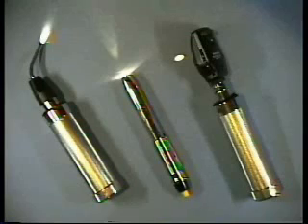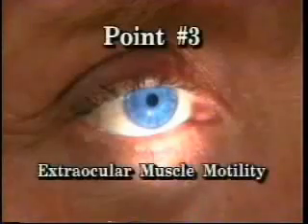The third through the sixth points can be evaluated with a Finoff transilluminator, pen light, or the ophthalmoscope light. Point three: extraocular muscle motility. Initially, have the patient look towards your light and assess the location of the light reflexes. If in the middle of the pupil, then the patient's eyes are aligned. Then check versions by having the patient follow the light or other non-accommodative target in the six cardinal directions, observing both eyes. If the motility is full, record the versions as normal.